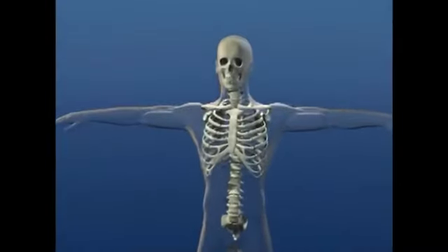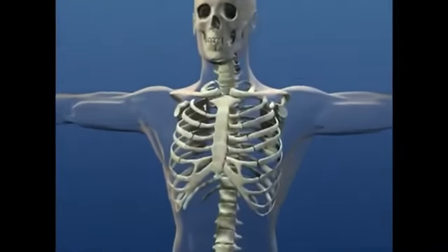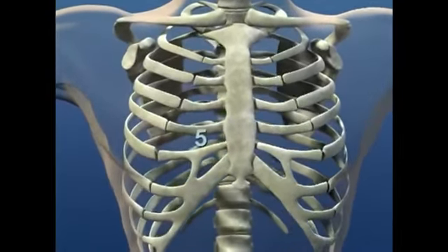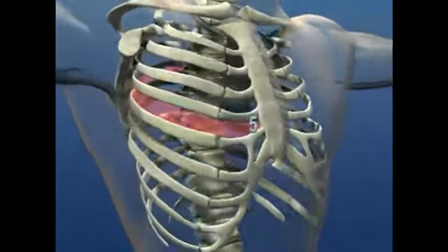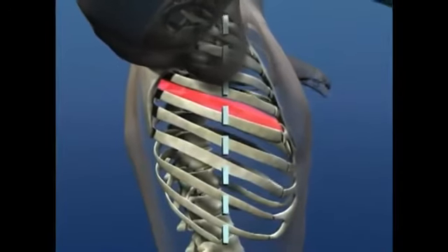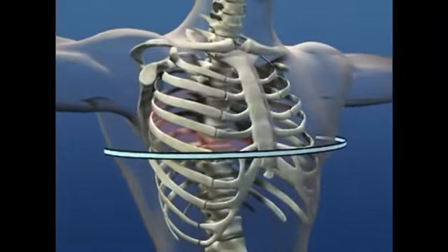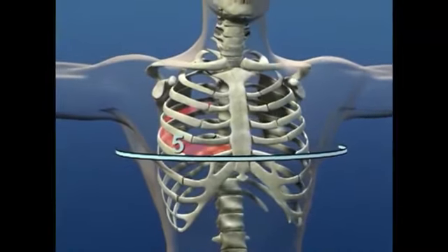The first step in the placement of a chest tube is to identify the insertion site. The insertion site is the fifth intercostal space just anterior to the mid-axillary line on the affected side. This can be found by using the nipple level as a landmark for the fifth intercostal space.